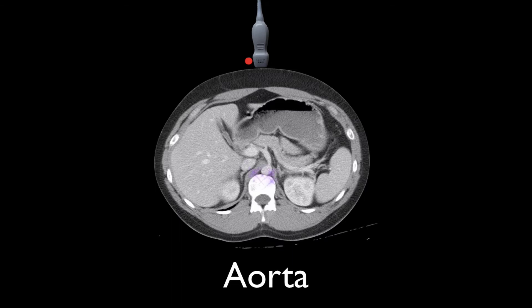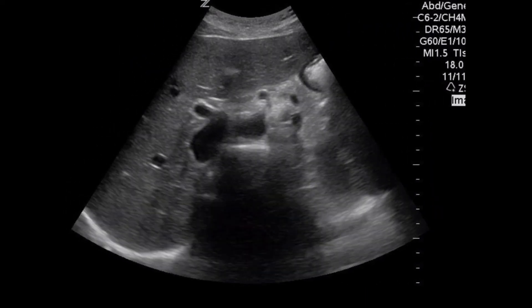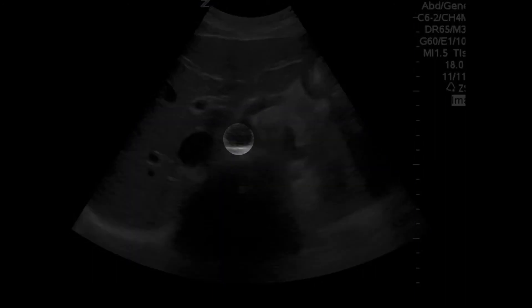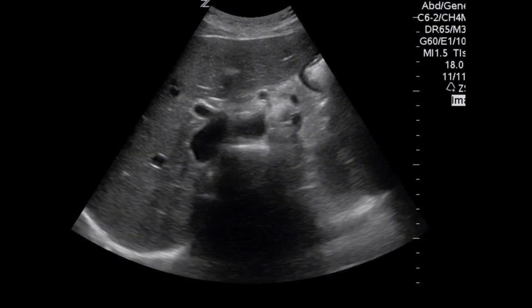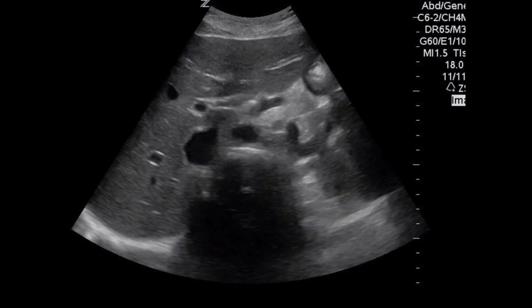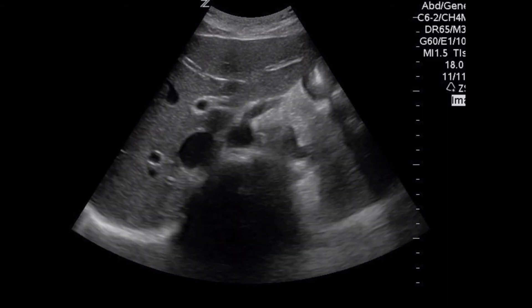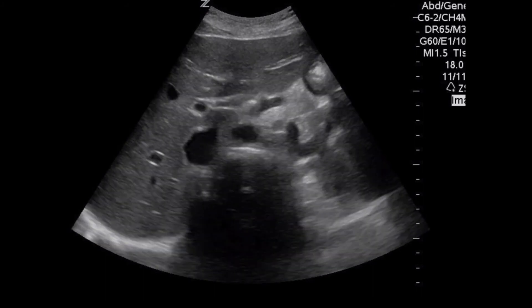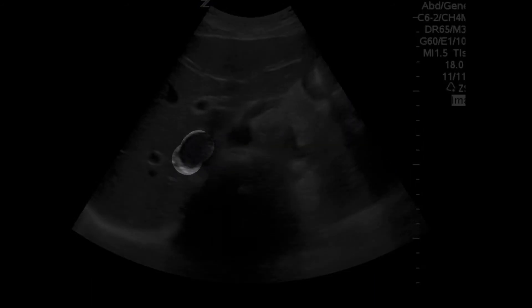The indicator is pointing towards the patient's right. The global landmark for the aorta is the vertebral body — it's a big bright structure that will shadow, and the aorta always sits on top of it on the left side. You'll also see the inferior vena cava on the right side — you don't want to confuse that for the aorta. In the subxiphoid space, below the liver and anterior to the vertebral body, you'll see a round anechoic pulsating structure — that's the aorta. We want to see it less than three centimeters. If it's more than three centimeters, that's an aneurysm; more than five centimeters, we start getting really worried.